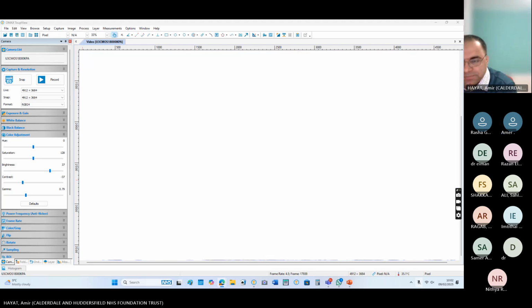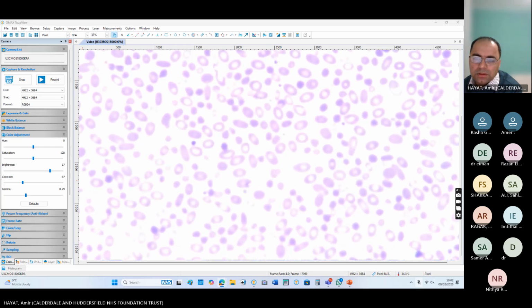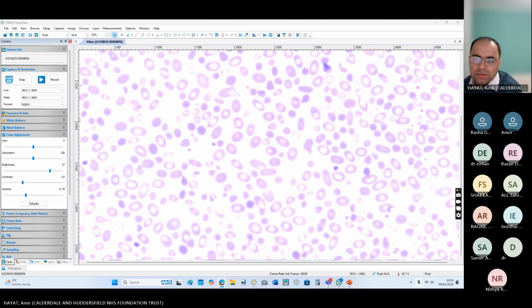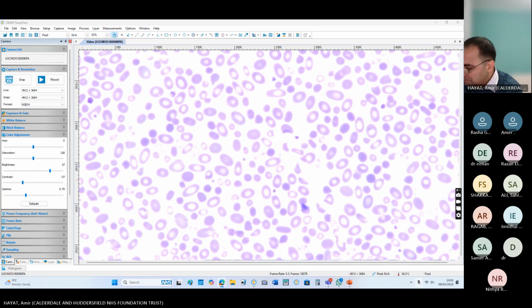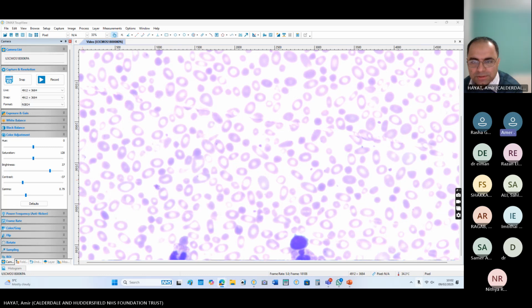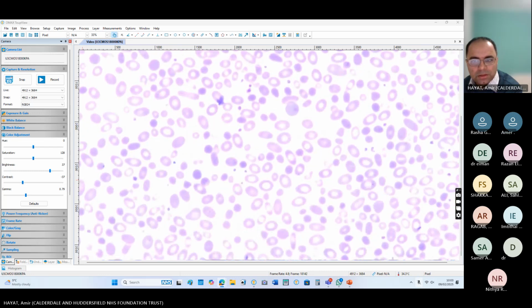This is power 50. You will see this film in your exam if you are going for part 2.